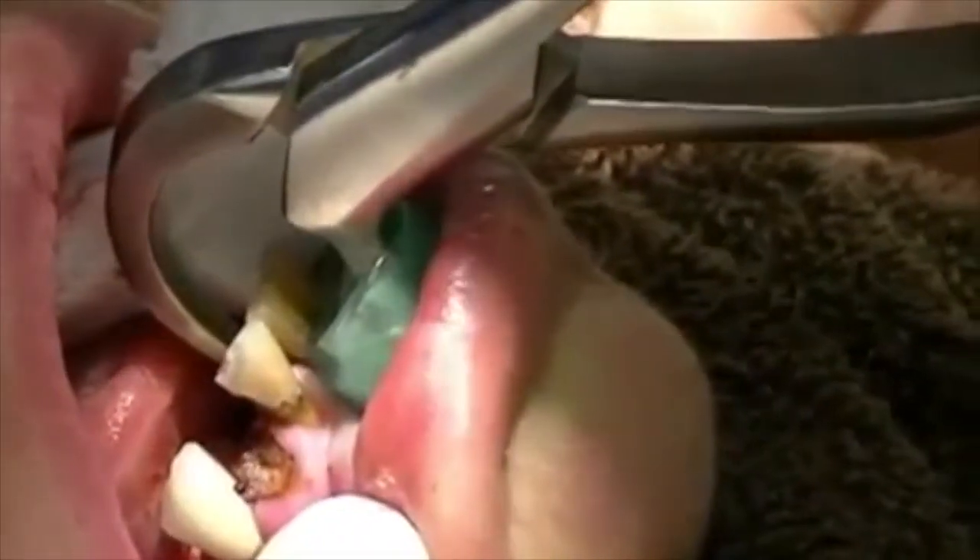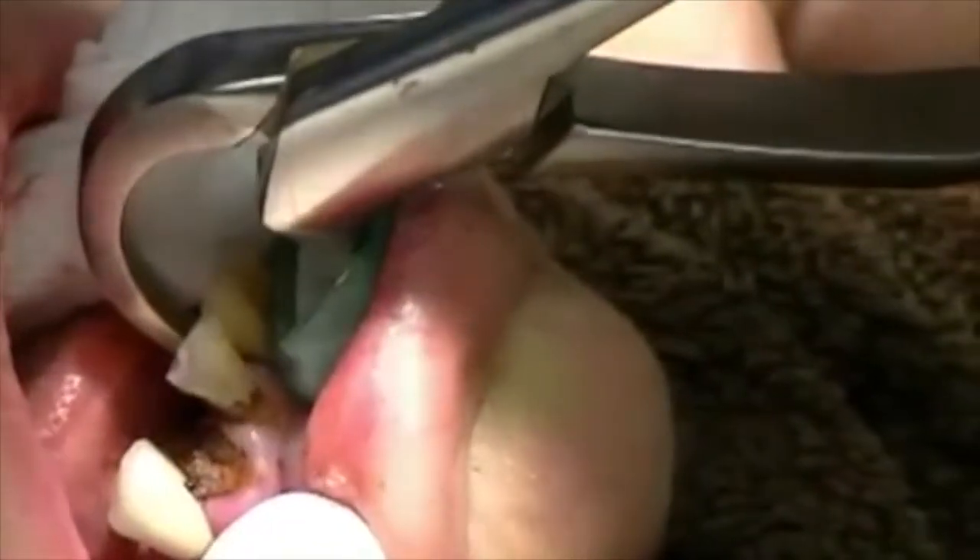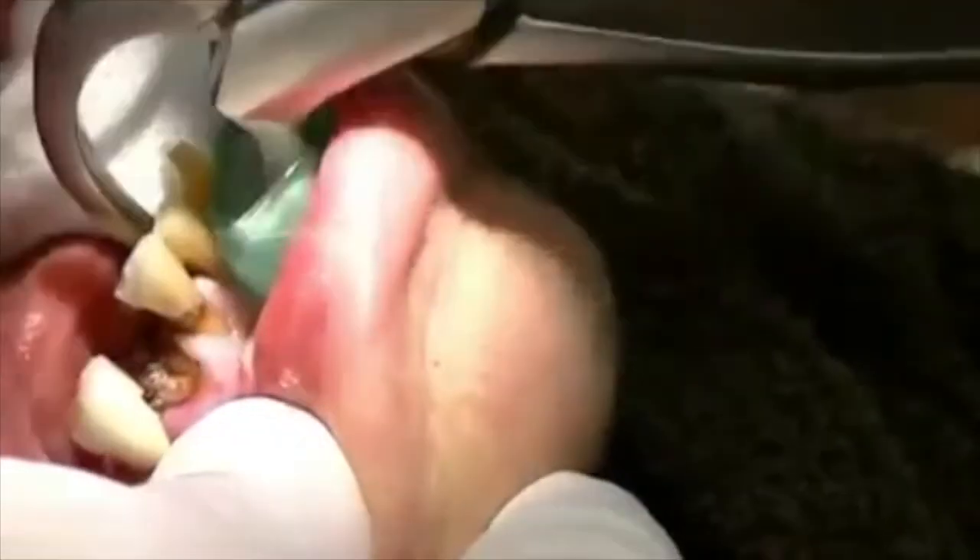I'm using my left hand for video demonstration, and the tooth just popped right out — or I can simply remove it with simple finger pressure.